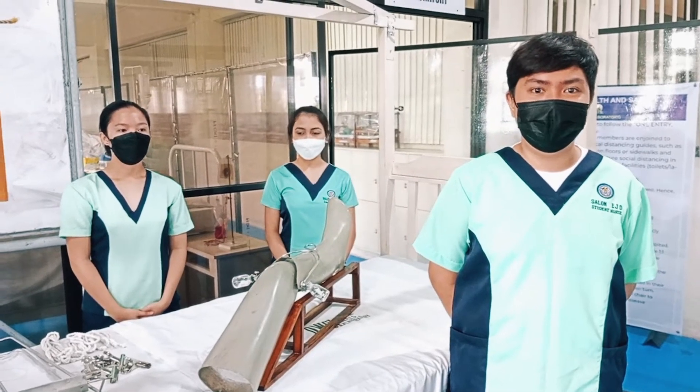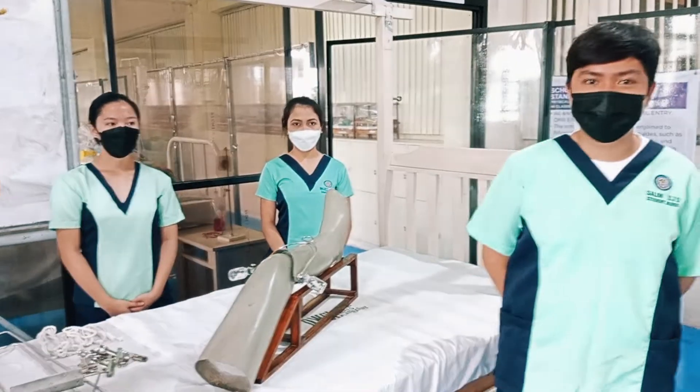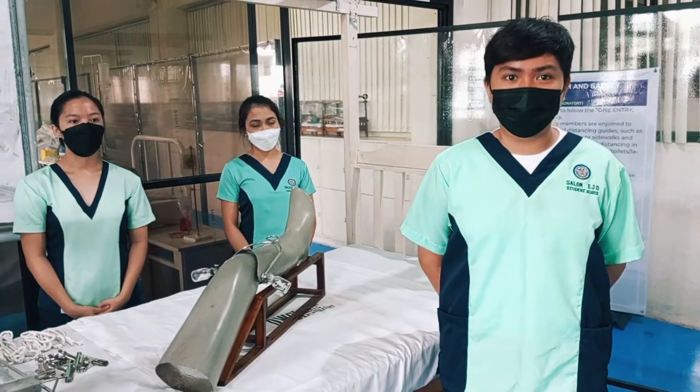Good day. We will be performing balanced skeletal traction. So what is traction? Traction is the act of pulling and drawing, which is associated with counter traction.